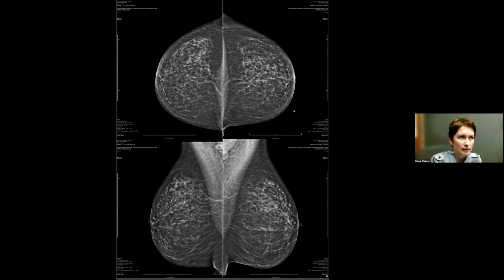And how you set it up on your PACS really depends on your preferences, on your vendor. The beautiful thing about CEM is that you can seamlessly incorporate it into your current mammography hanging protocols. If you have DBT, for example, you probably have a set of keys or shortcuts that you are using, or a pad to scroll from low energy to DBT.